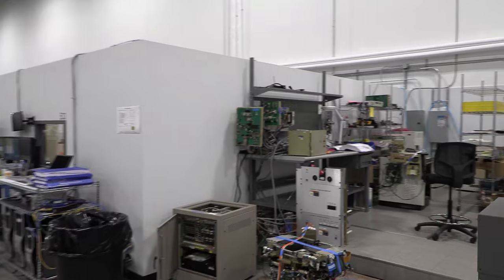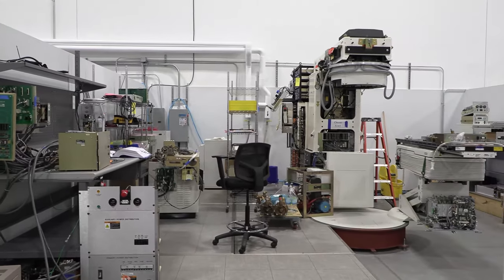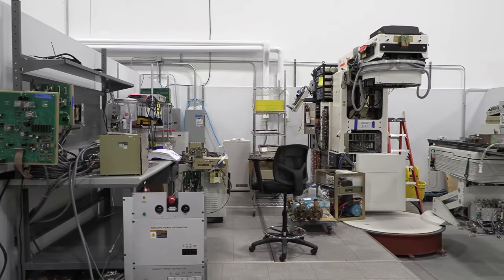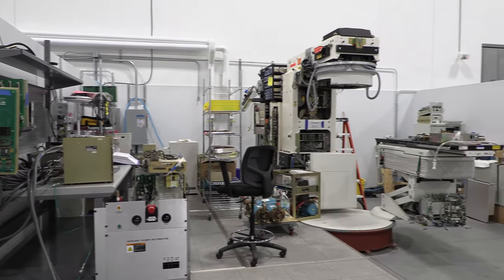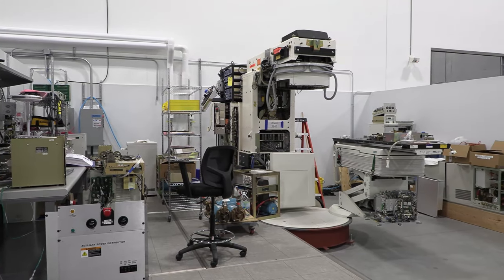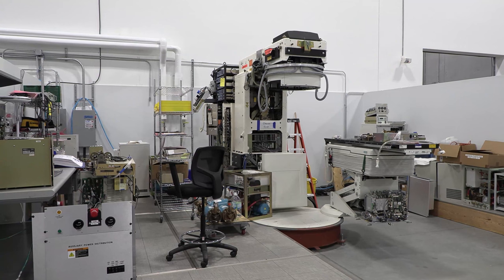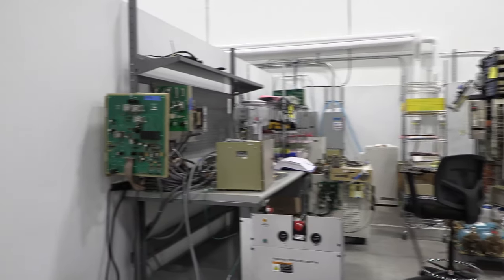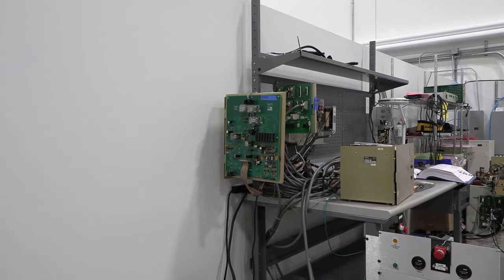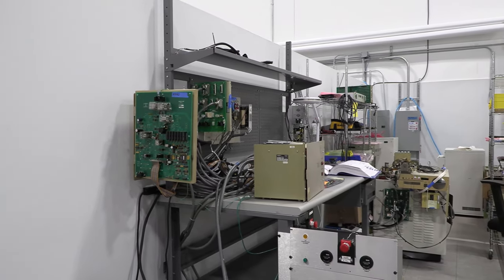I think this is the best explanation of what's really going on with a linear accelerator. This is the Siemens bay. We kind of use this as our other test bay. We've got a lot of stuff going on here. I try to build a lot of test jigs. What's going on right here is basically the inside of the Varian machine that we have on this bench. We don't have to put a bunch of parts in the machine, we just test it right here. Quicker, faster, and we're not tying up a whole machine with some tests.